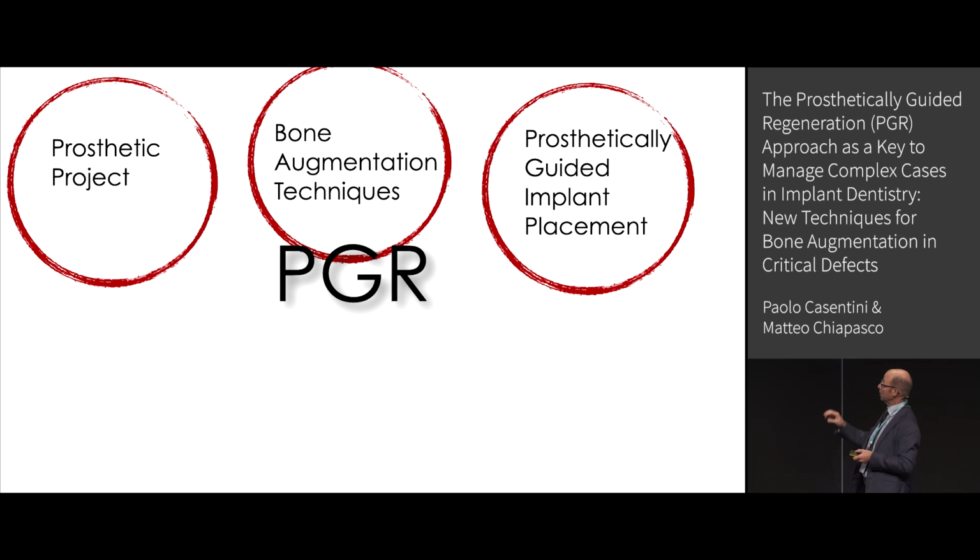guided implant placement, but also the bone augmentation is guided by the prosthetic plan. So every case I plan, I will do it always after his consultation. I never place a block like 40 years ago.